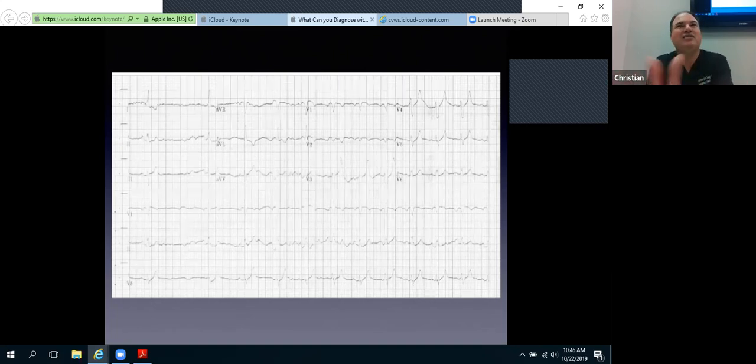So this was diagnostic. This is one of the main reasons I wanted to teach this particular issue, so that we all recognize, in the future, if we get a trauma patient that has peaked T waves and that looks bad and they're in cardiac arrest, let's treat what the information is.